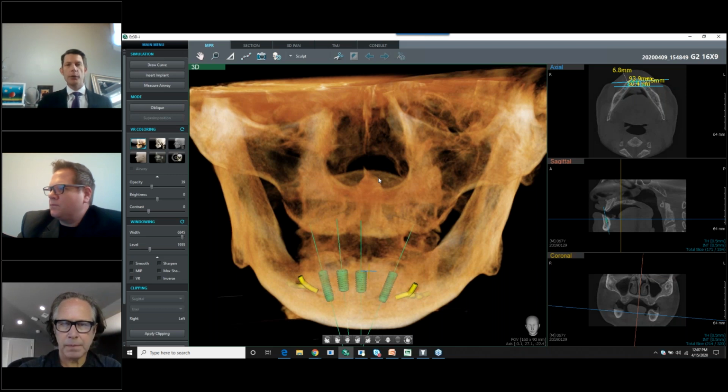So we make it very, very simple to work with them. You're still going to go through the live session. They're going to talk to you about your implants, your guide, and some specifics, and review the case. Then, like the doctor said, you're going to get your guide back in the mail within a short amount of time.